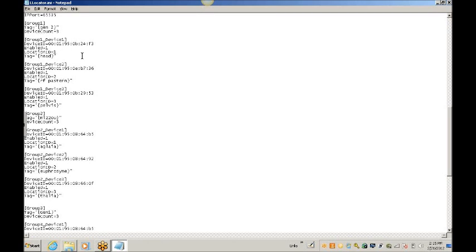and then you need to determine which sensor you actually need to update the Bluetooth information on. If you're just changing one sensor, then you'll just be changing one address. If you're changing multiple, then you may be changing multiple addresses. So, Group 1, Device 1. Device 1 is the head sensor. Device 2 is the right front pastern sensor. And device 3 is the pelvic sensor.